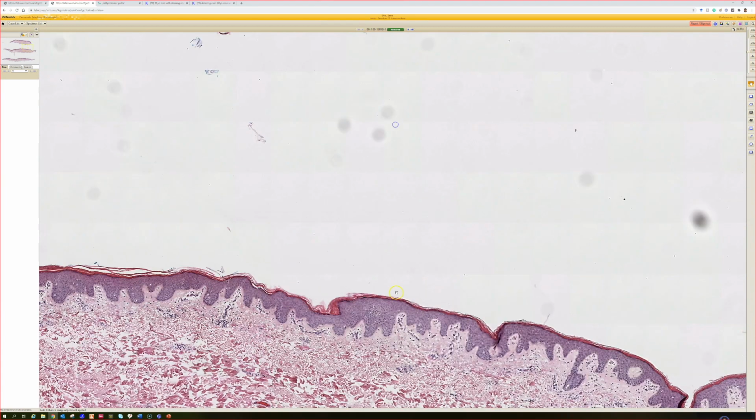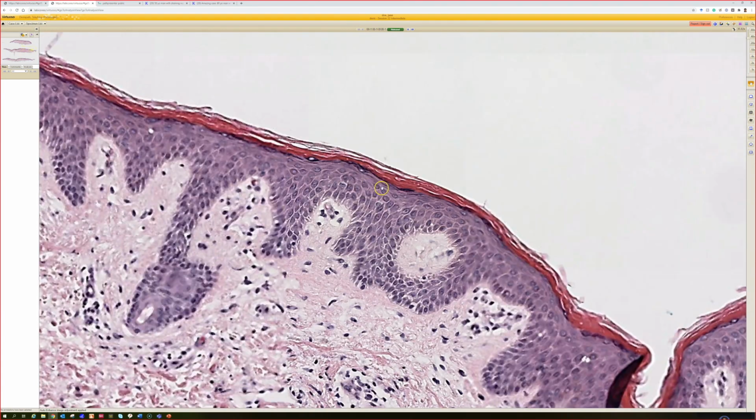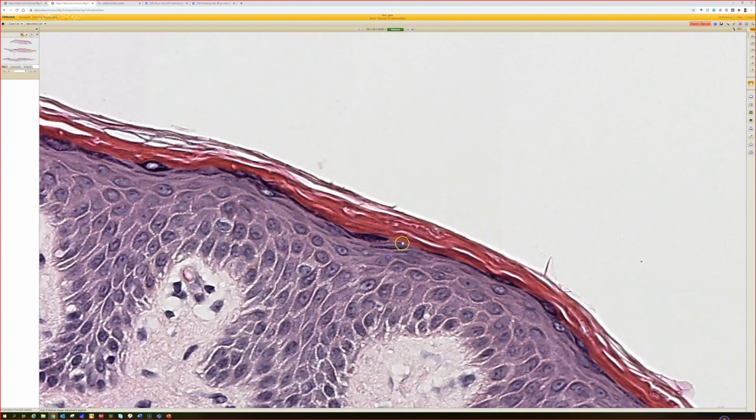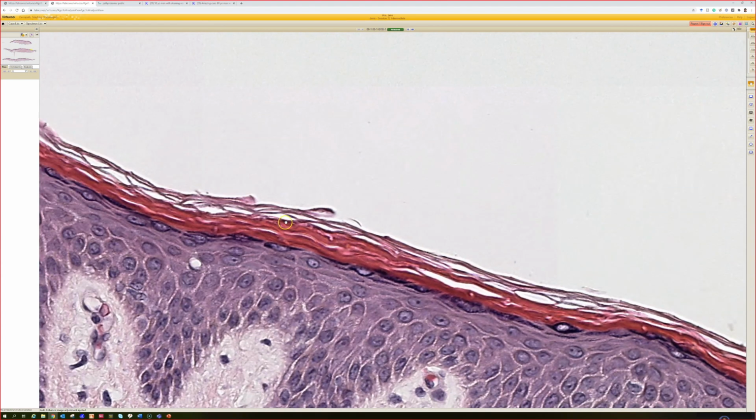What are some other clues microscopically to dermatophyte? When should we think of dermatophyte fungus? Oh, here, look at this. This is a nice longitudinal. Oh, it says this is the max. There's a longitudinal hypha right there, right there. And again, some little cross-section tubes. But it's kind of subtle, even in this case, which is florid.